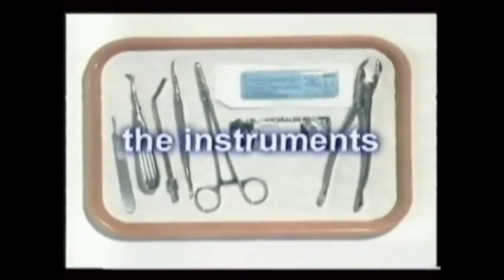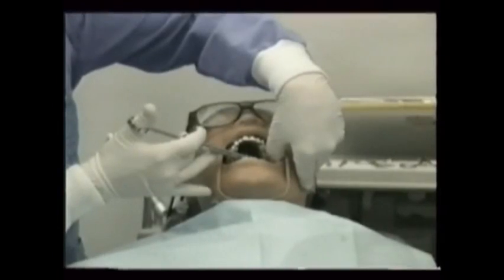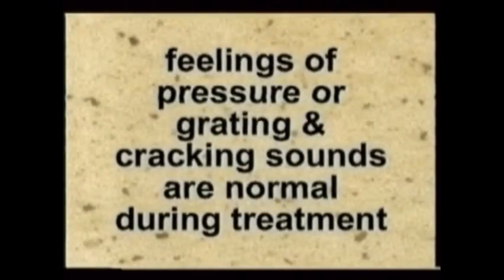Let's discuss the instruments that we'll use in oral surgery, in the sequence of use, and walk through a procedure like an extraction. We've already mentioned the basic setup, which the doctor used in the examination, and we talked briefly about anesthesia. Now the treatment is ready to begin, but first, make sure the patient knows that feelings of pressure or grating or cracking sounds during the treatment are perfectly normal, caused by the tooth being gently released from its socket.